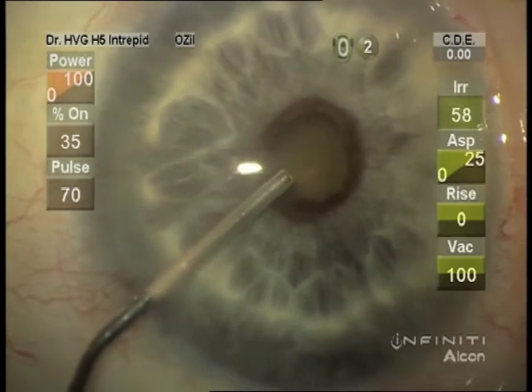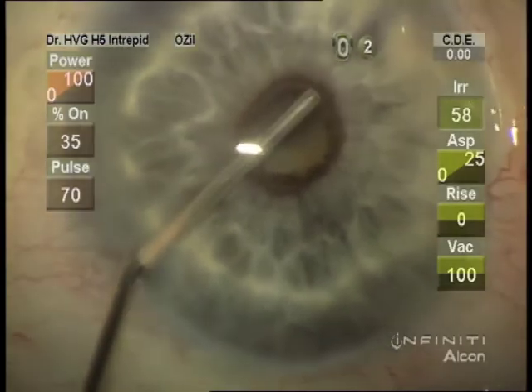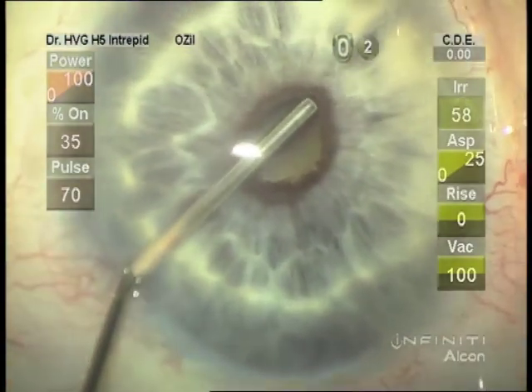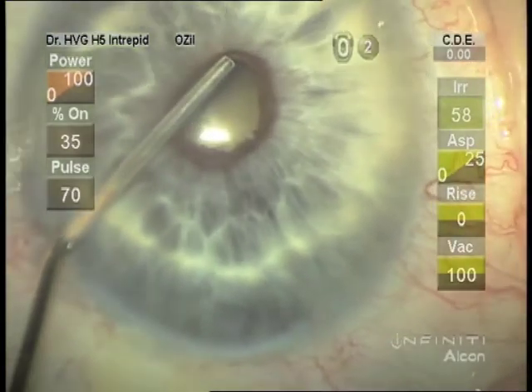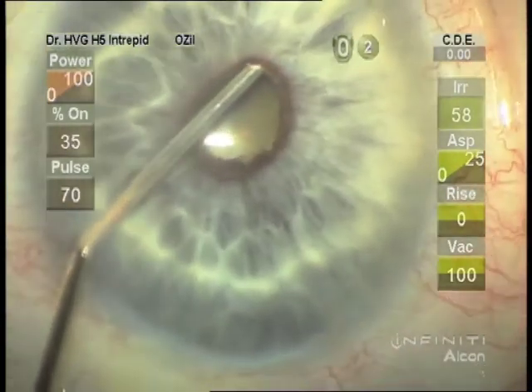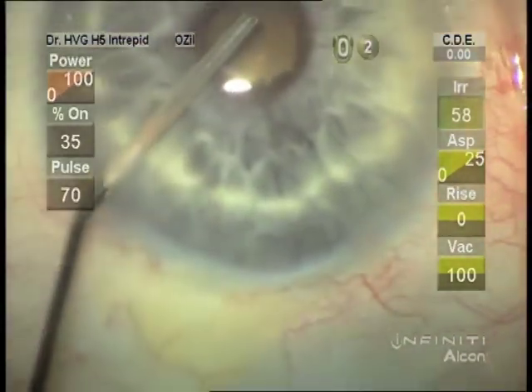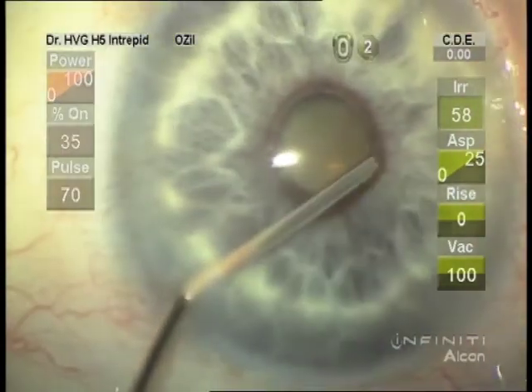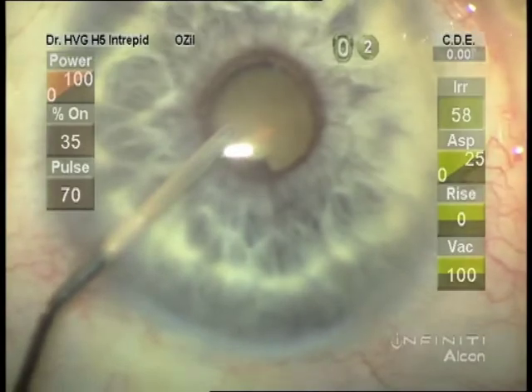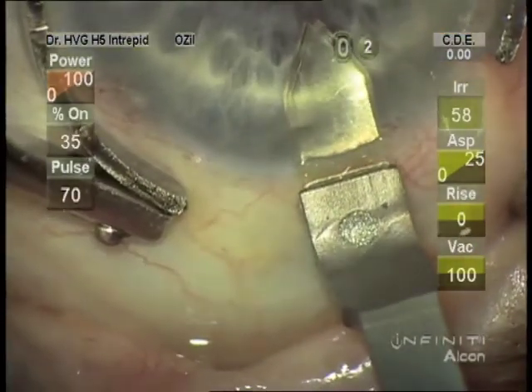This pupil certainly needs a pupil expander. Very small pupils like this can have fibrotic elements that will require cutting or tearing to get the pupil open enough. We can see there are posterior synechiae here, and I am putting viscoelastic underneath after breaking the synechiae.